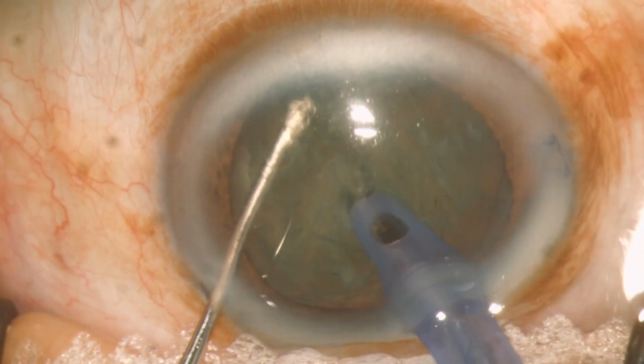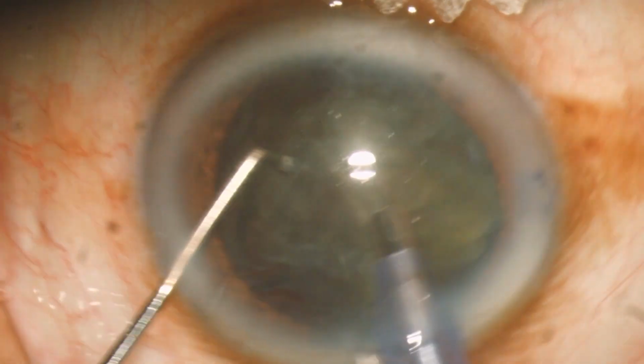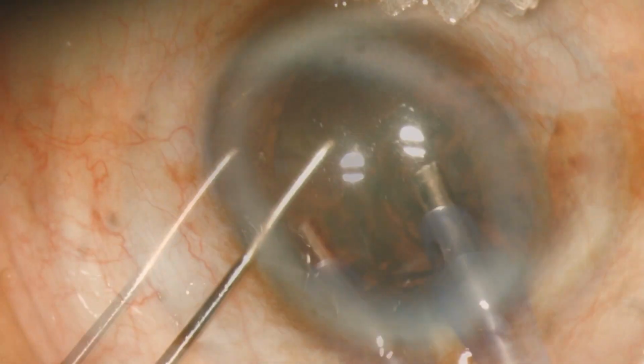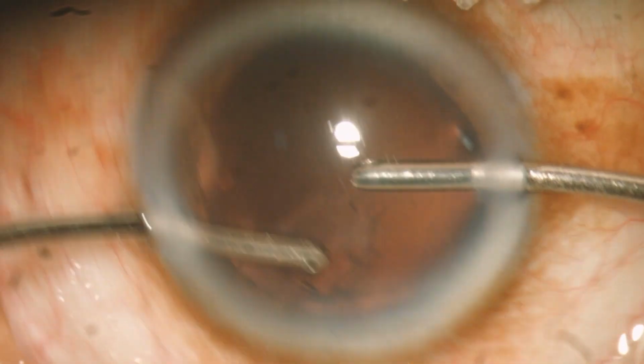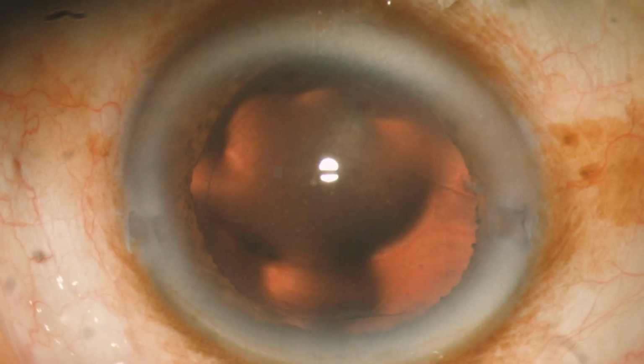Here we are using the wet chop technique, which doesn't require ultrasound to fracture the nucleus. Despite its thickness, the cataract wasn't too hard and we had no issues removing it completely and without complications.